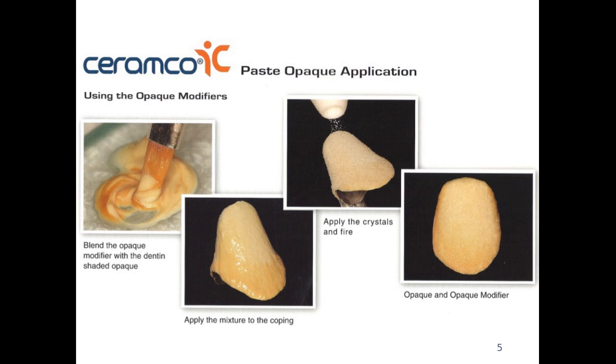We can use different opaque modifiers — mixing the opaque with some stains to get the desired shade. In this case, a little darker brownish stain was applied to the gingival portion of the coping. After the application of the stain, we apply the crystals and fire the porcelain. After the bake, the coping has a nice shade that goes from a little bit darker towards the gingival to more lighter towards the incisal.